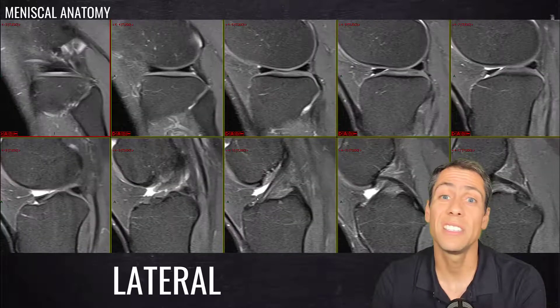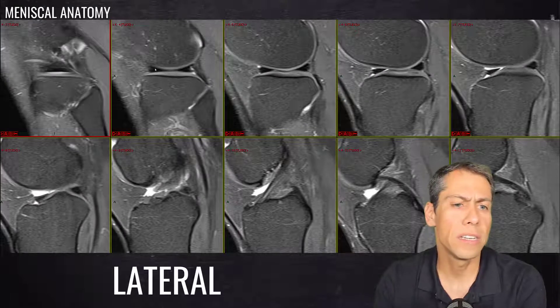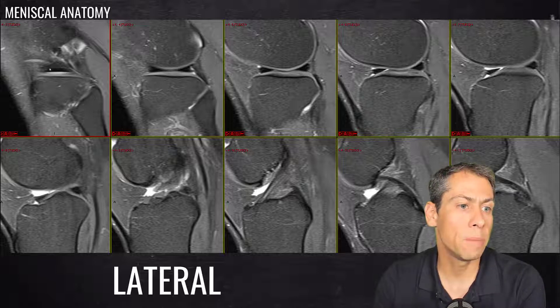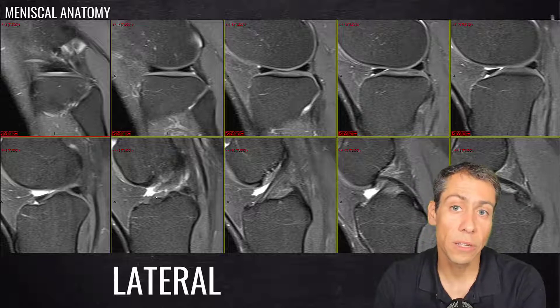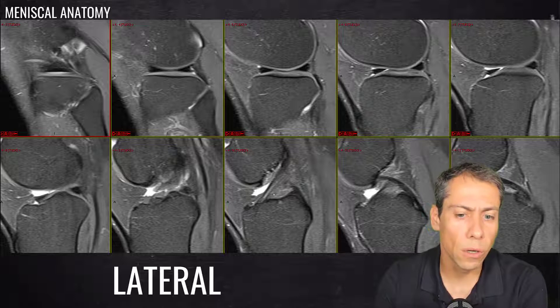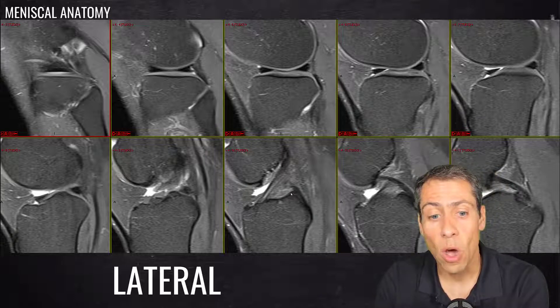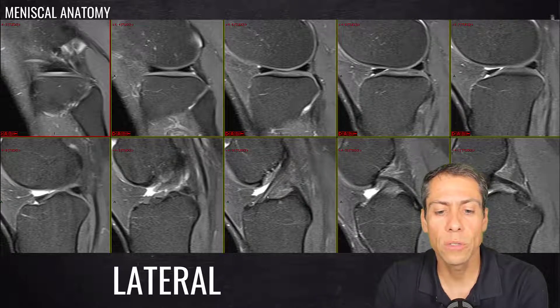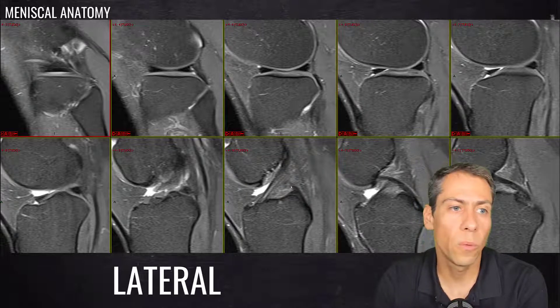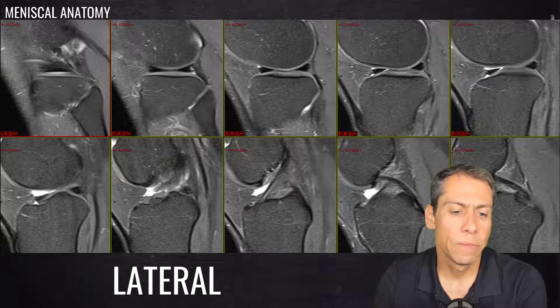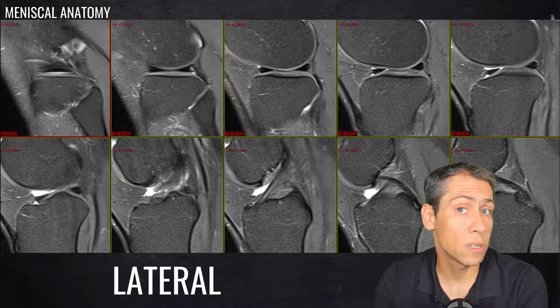For the lateral meniscus, it's the same thing. Here's the lateral meniscus — we can see the anterior horn, the posterior horn, and the bowtie morphology. Here is the meniscal body on the long axis, and here we have the anterior root ligament of the lateral meniscus, a very close neighbor of the ACL, the anterior cruciate ligament. And here's the posterior root ligament of the lateral meniscus — it's a tricky one to find, but we can find it when we triangulate between the sagittal and coronal planes.